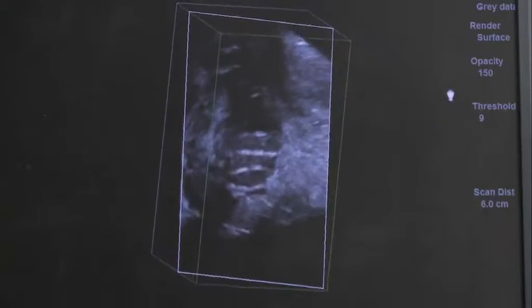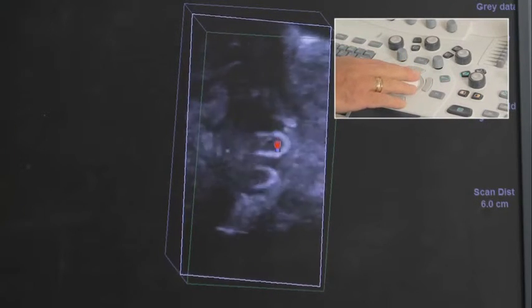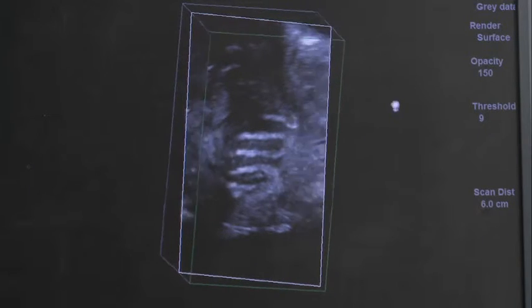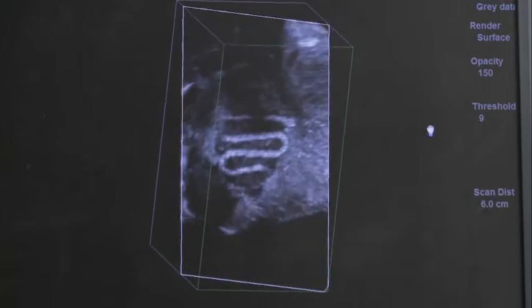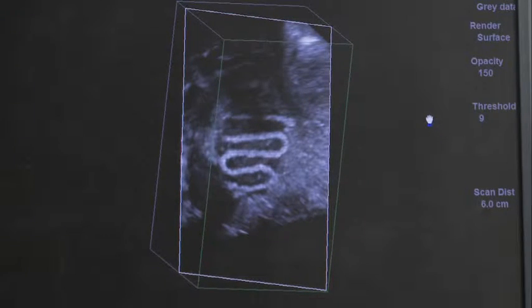To do this, set the hand inside the cube with the right trackball key and translate back and forth using the trackball. Set the hand outside of the box with the right trackball key to manipulate the data set in any angle to visualize the anatomy of interest.